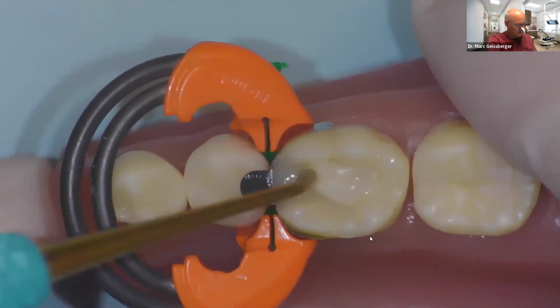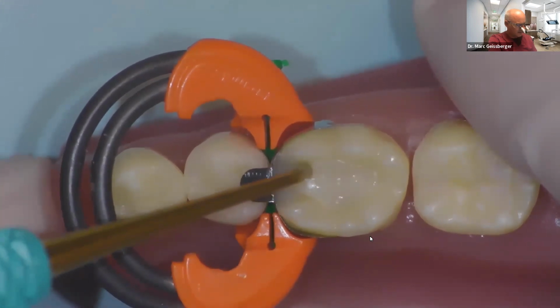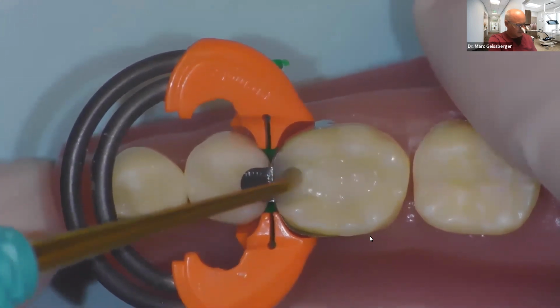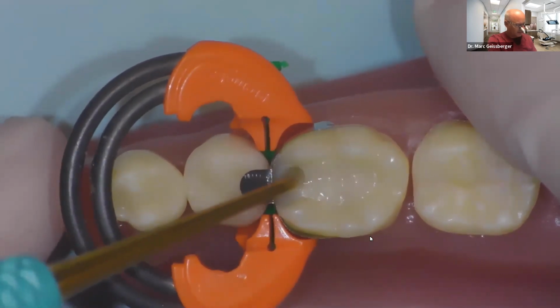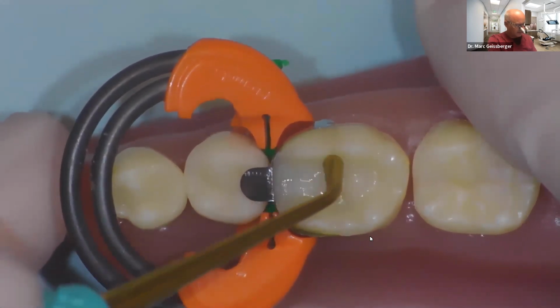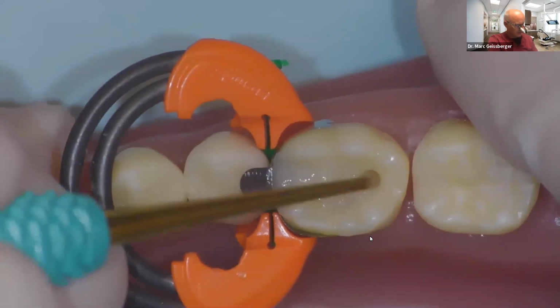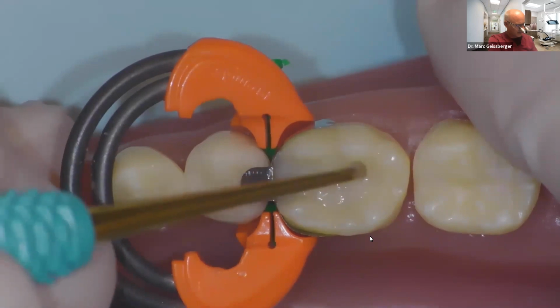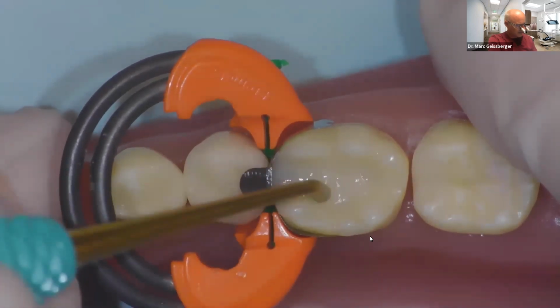Now I'm going to condense this, and I want to leave it deep enough so I can form a central fossa. Now I'm beveling that towards the mesial. I dip my instrument in resin blend. Now I'm going to basically start feathering this composite. And I want this layer to be a nice, smooth layer to accept my next layer.